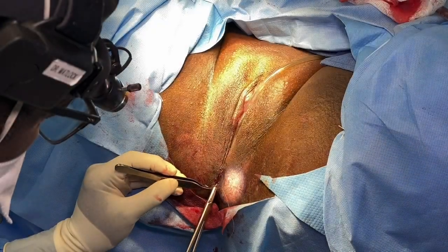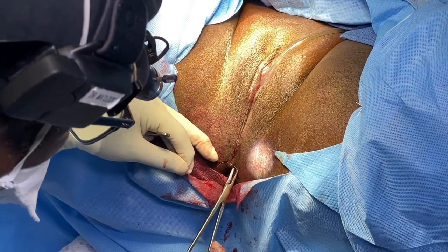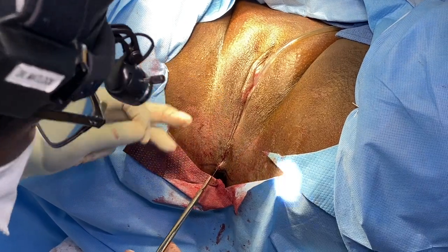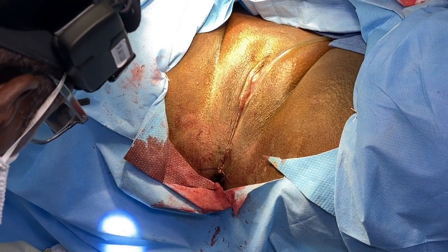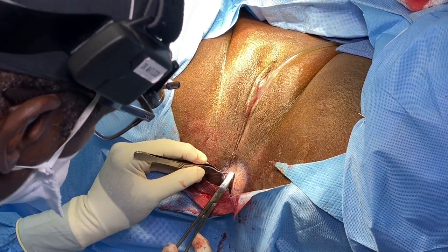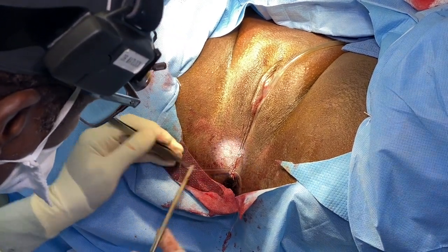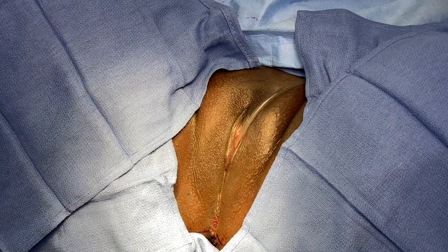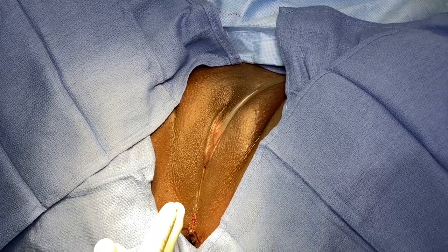Just for the repair so far, I will put a couple of interrupted sutures here. Again, this is all absorbable, there's nothing to remove. We'll bring it back in. Okay, now we completed our laser vaginal rejuvenation procedure.